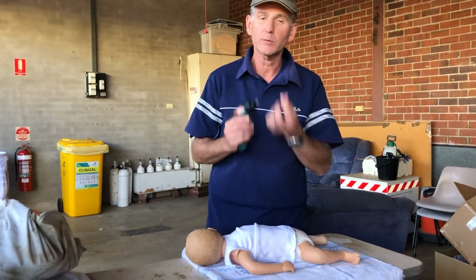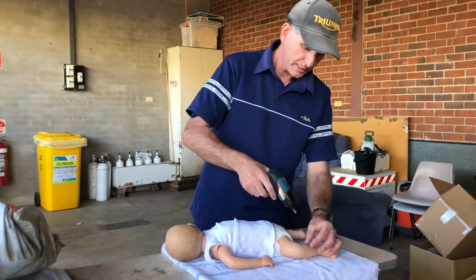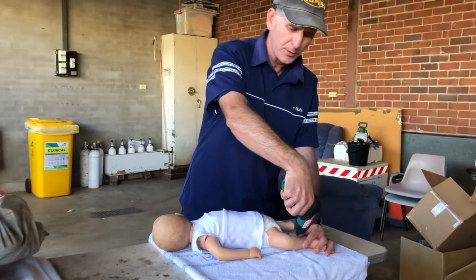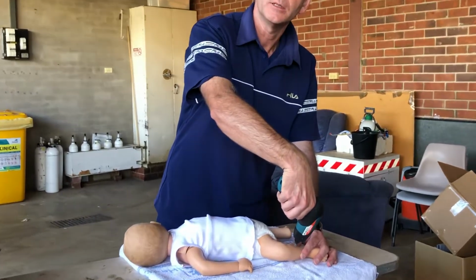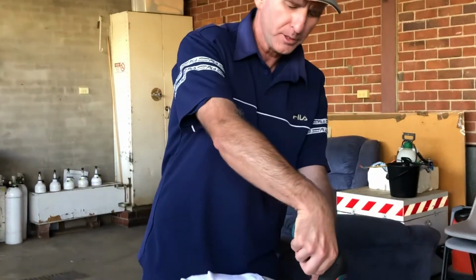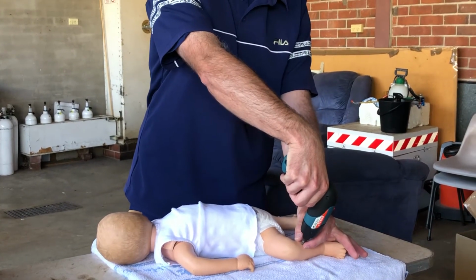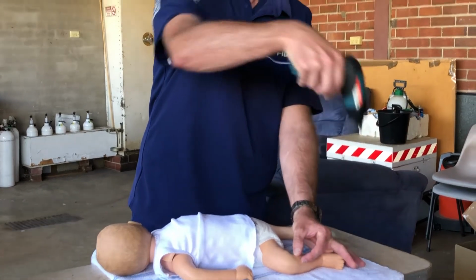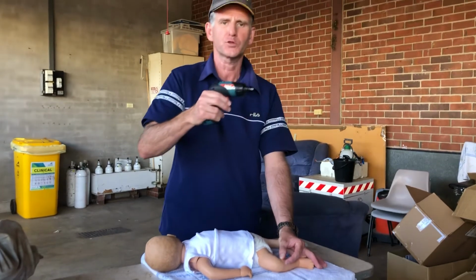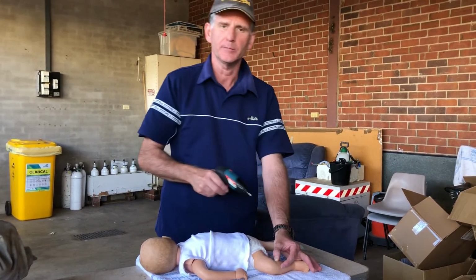So once we've decided what size needle set we're going to use, we place it in. We go to the depth of the bone, and then we drill till we hear a pop. Pop! Now that we've got a pop, we leave the needle in situ. We hold the needle set, and we take the drill off. We make sure that we don't drill while we're pulling off, and we have to hold the needle hub in position.